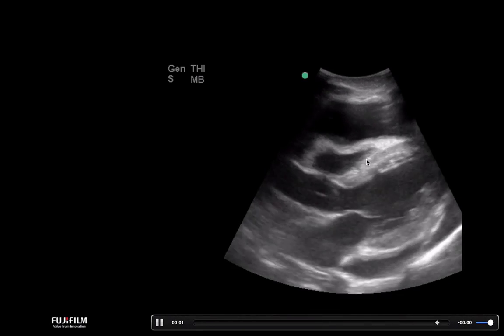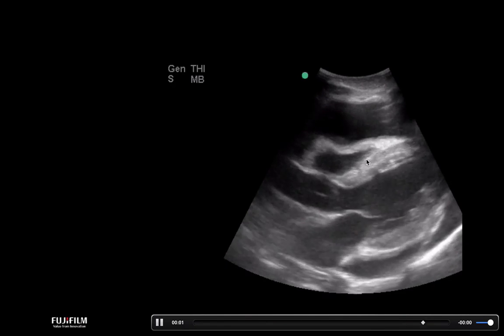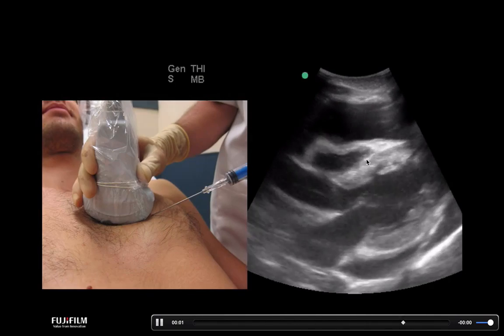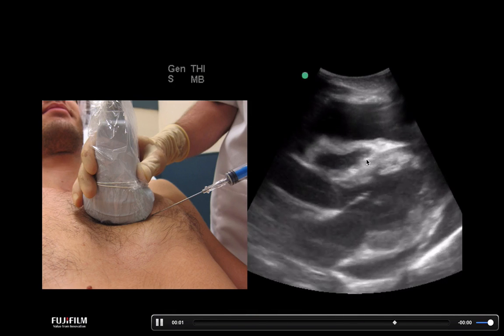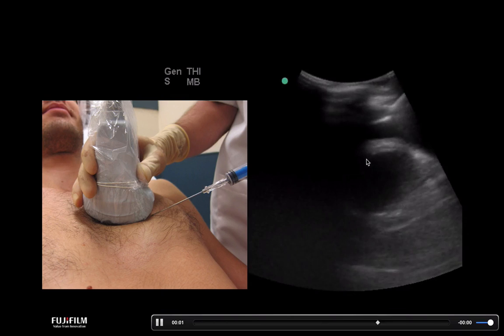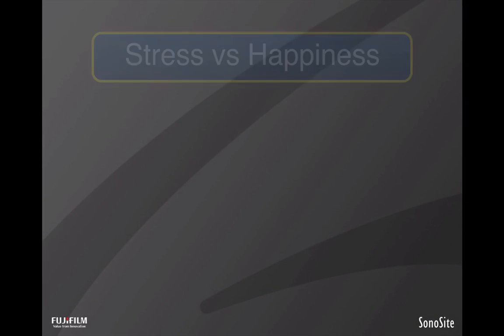You can see that kind of scalloping. The beauty of this is, again, I made the diagnosis fairly quickly at the bedside with a quick ultrasound evaluation. And second, using just some basic techniques, which is in-plane visualization of the needle tip, I was able to guide my needle directly into that space, slide a wire in, and pull out the effusion.